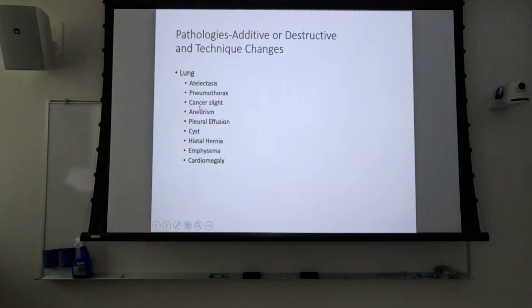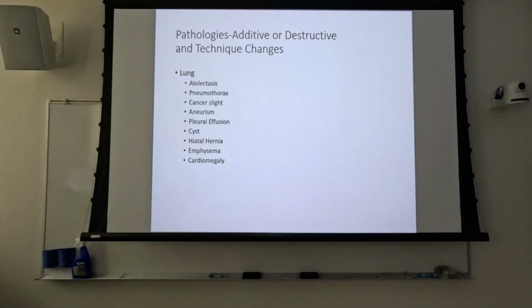All right, so cancer. Anybody seen a bad chest cancer? Lung cancer? I think it was cotton balls. Yep, it's kind of subtle. It's like you took cotton balls and dipped them in just the slightest amount of barium or milk and put little dots on the screen. So it's an increase in patient density, but it's pretty subtle unless it's really bad. Does it really need that much of a change in technique? I'd say probably not.